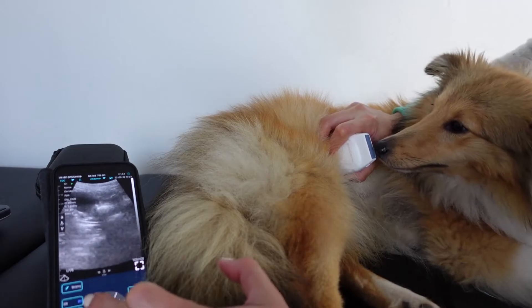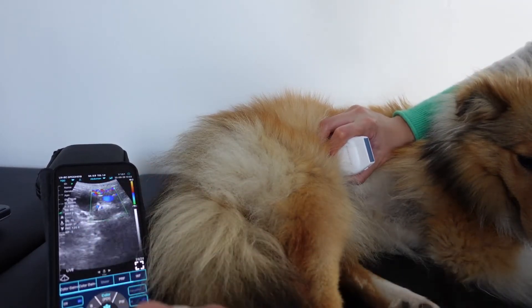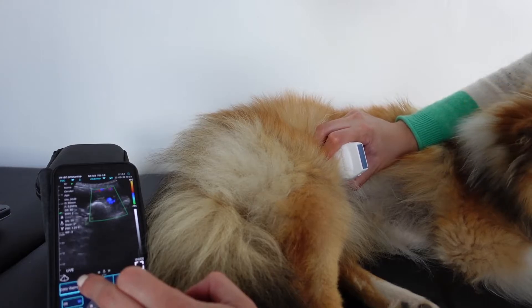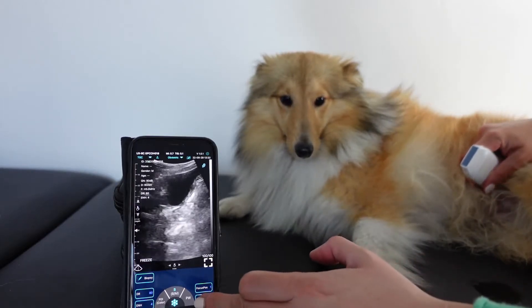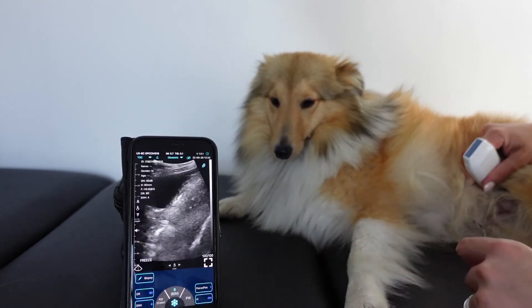This probe's colour Doppler performs surprisingly well once colour gain is optimised. Turning harmonics on makes quite a big difference to the image — harmonics off versus harmonics on.